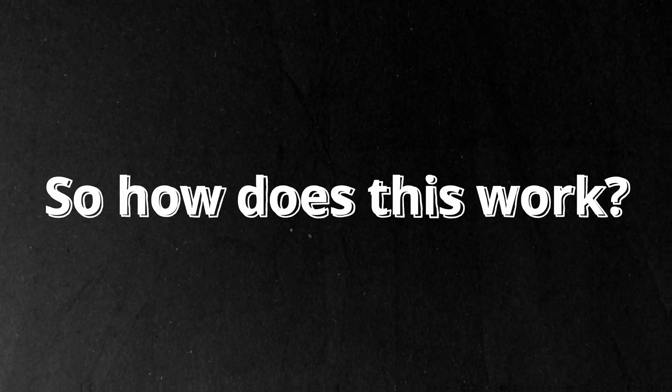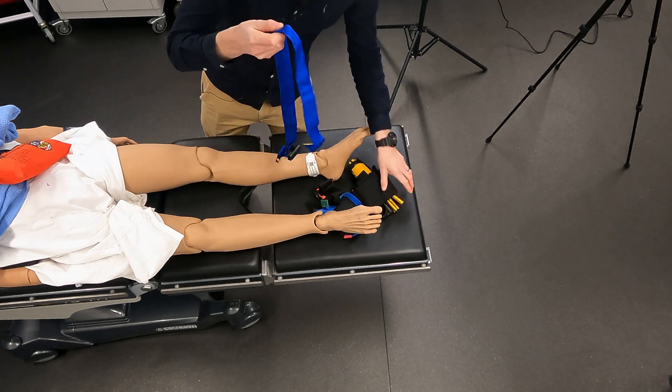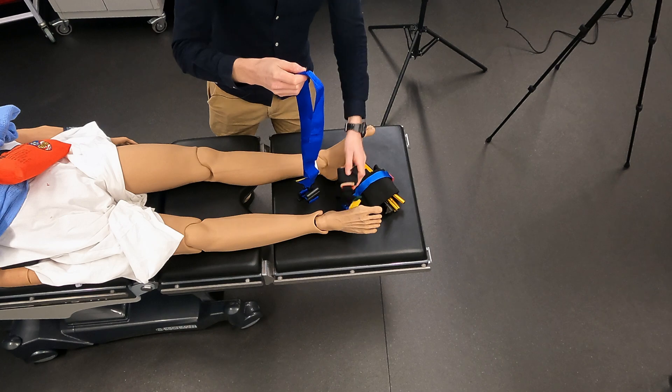So how does this work? In the bag there should be at least three things. There's the poles, the groin strap, and the ankle strap. What goes on first? The groin strap.